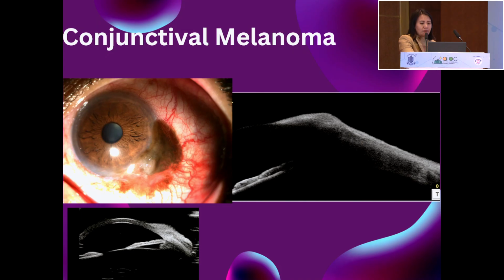Another corneal conjunctival mass lesion is a melanoma. How is it different from an OSSN? Here you can see that the epithelium may appear a little hyperreflective, but it is not hypertrophied, and the subepithelial Bowman's membrane plexus could have some hyperreflectivity. This hyperreflectivity is basically due to the melanocytes that are deposited in the subepithelial space.